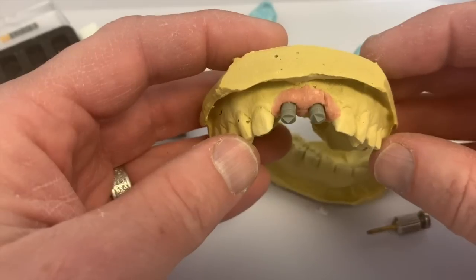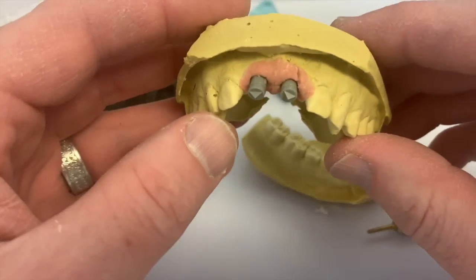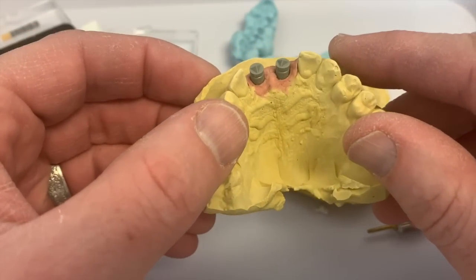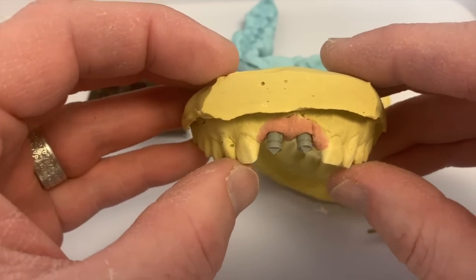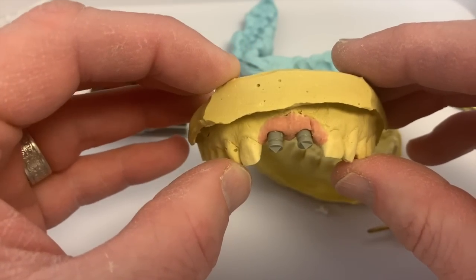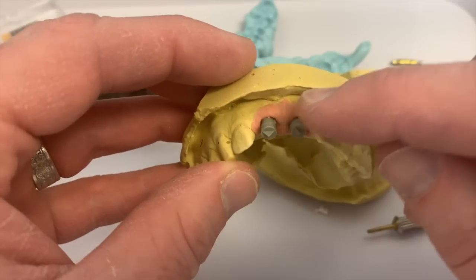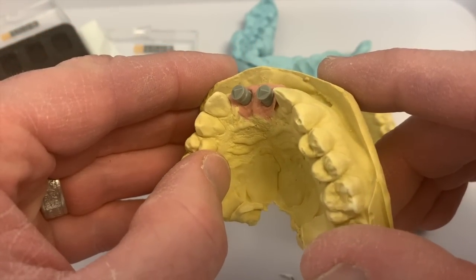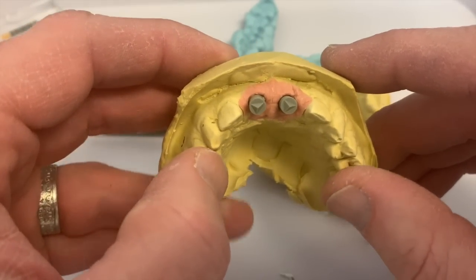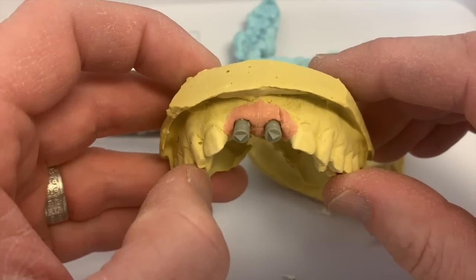Well, 4 images, I guess. An upper, a lower, a bite, and the tibase scan. Some people, you can actually use the upper, in this case, and the tibase as the same image. You can copy it and move it, or copy it over to the other image set. But generally, when you've got some soft tissue that we're working on, you want to make sure that you have a really solid, separate image that shows the soft tissue, so you can toggle it on and off during the design phase.